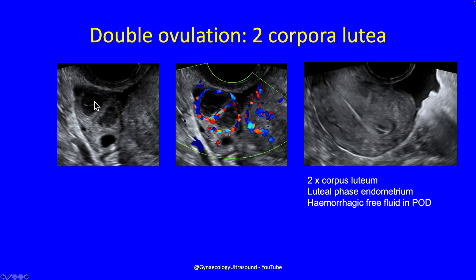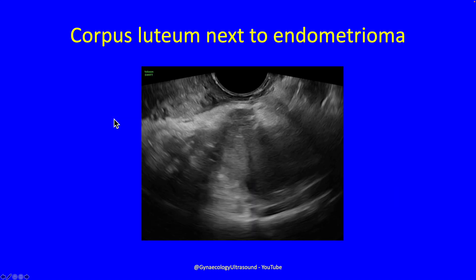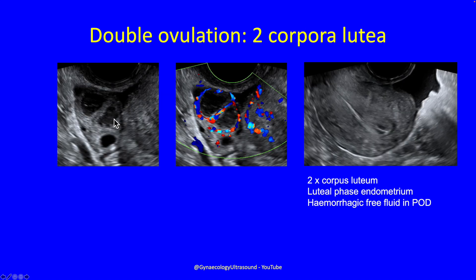In this case, it's not quite clear — there's been some haemorrhage, but what is it? When you put the color Doppler on, you can see that this is a double corpus luteum, and that the endometrium is in the early luteal phase, and there is some physiological haemorrhagic fluid in the pouch of Douglas, all indicative of recent ovulation.